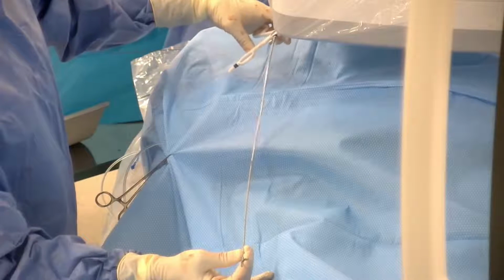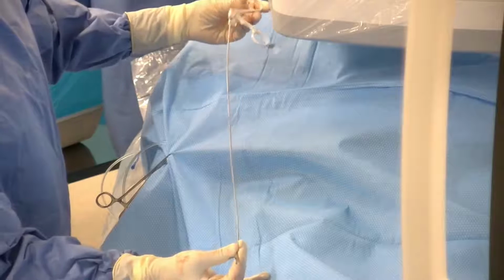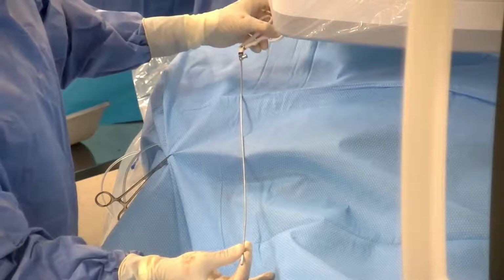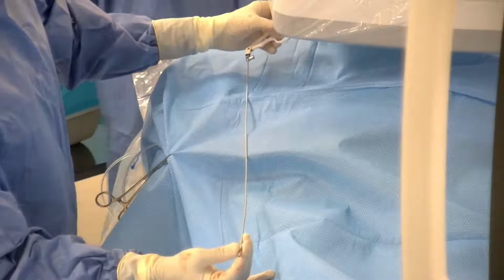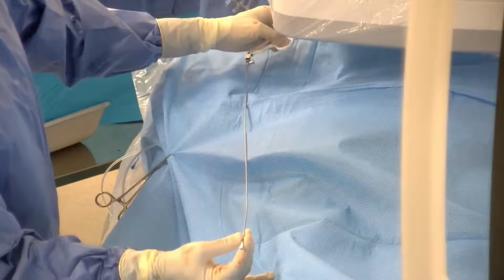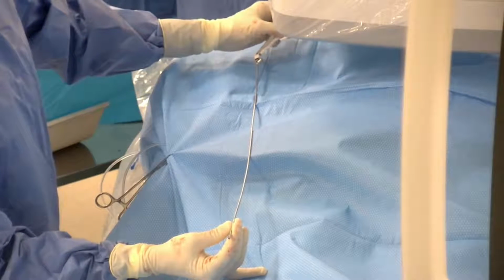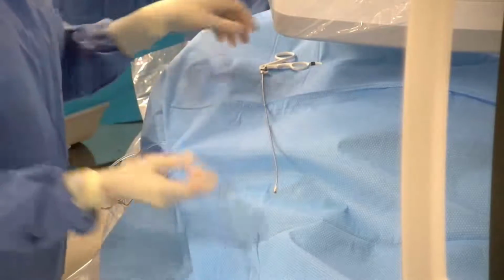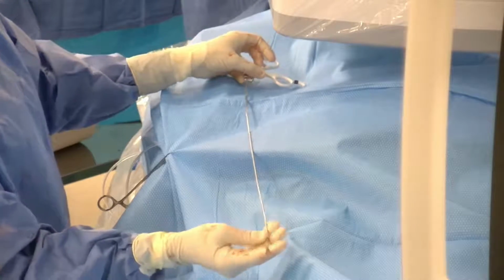And the idea here is to get this in there and then just turn it. The technique is basically to turn this and displace the tip of the filter off of the cava wall, and then go ahead and grab the apex and the hook, which in this case probably has endothelialized tissue encasing it. So that's what we're going to be doing here. These will go through a number of different sheaths, but we like the 18 here. Exchange it out for that.